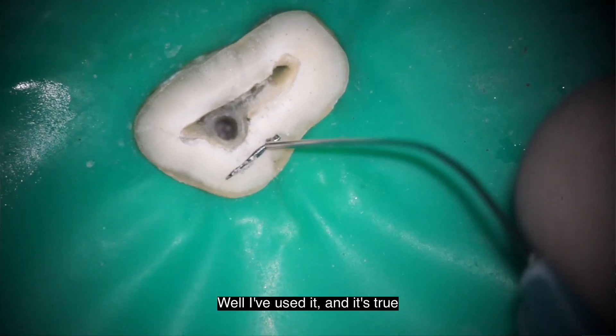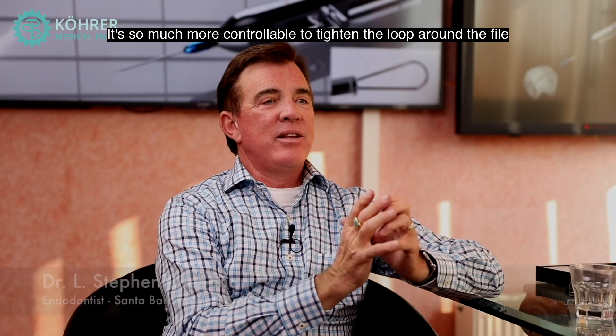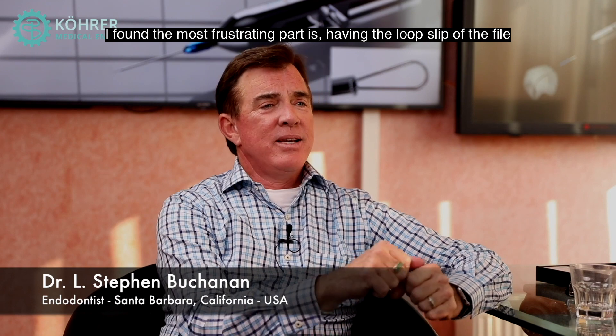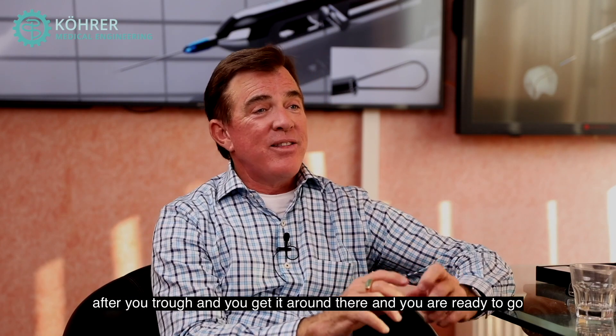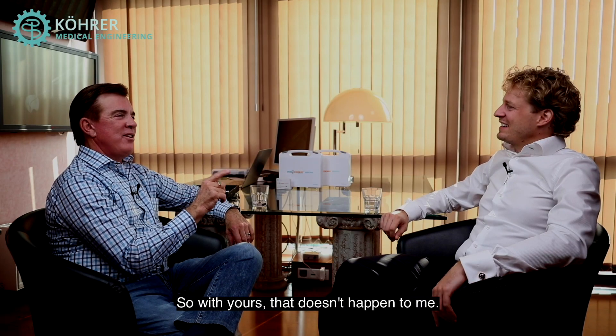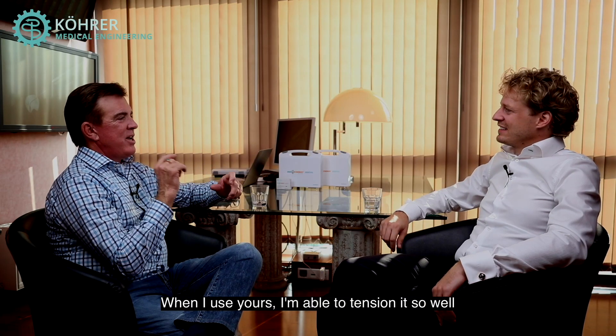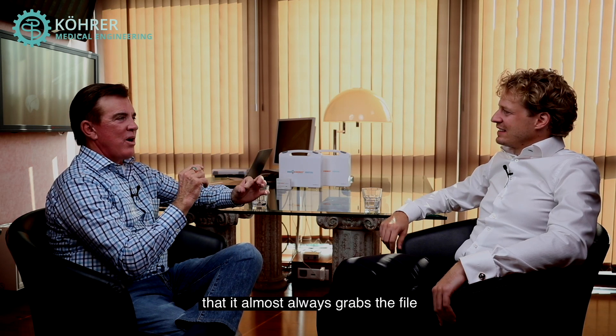Well I've used it and that's true, it's so much more controllable to tighten the loop around the file edge. The most frustrating part is having the loop slip off the file after you've dropped it and you get it around there and you're ready to go and it comes off three times. With yours, that doesn't happen to me.